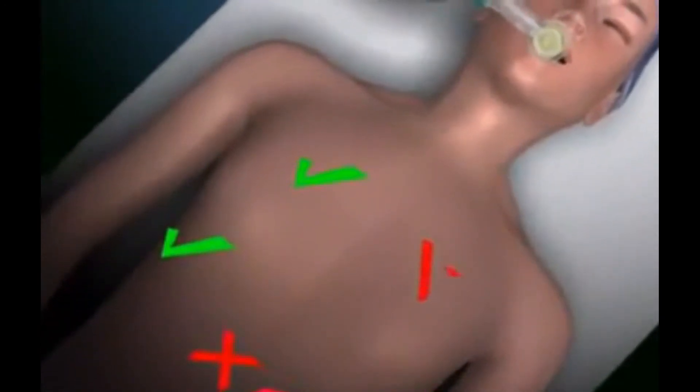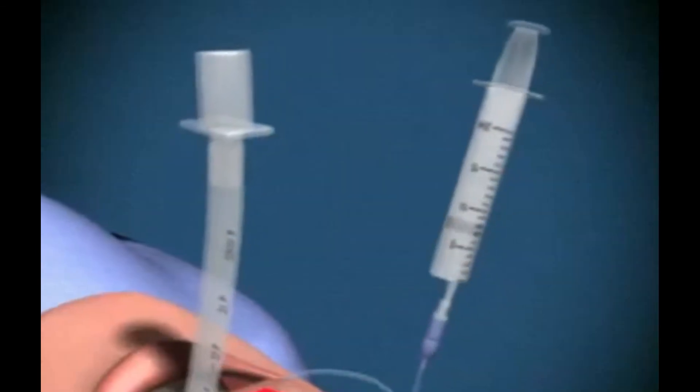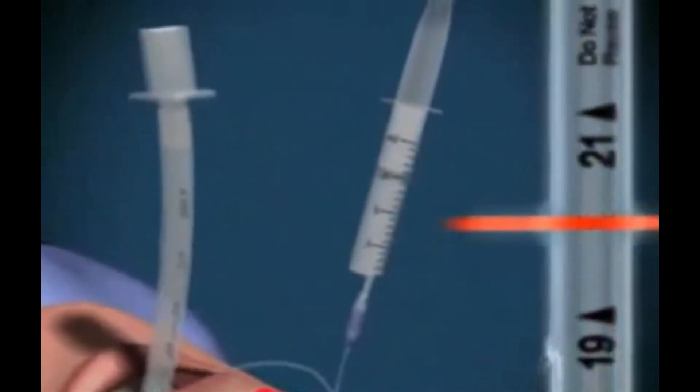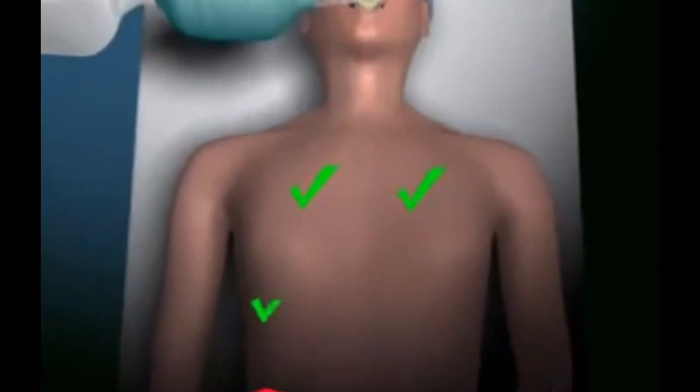If the tube is in too far, the right lung will be ventilated only via the right main bronchus. If this occurs, deflate the cuff and withdraw the tube 2 to 3 centimetres. Re-inflate the cuff and re-check the position.